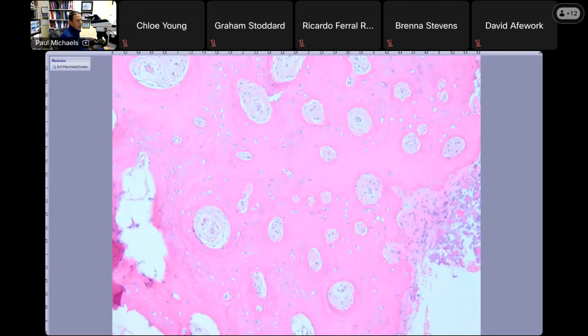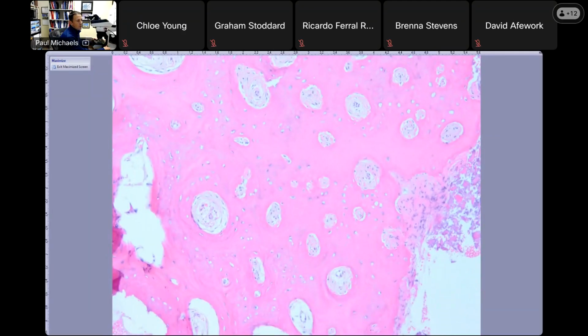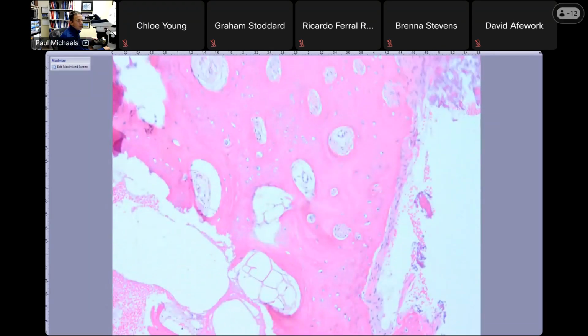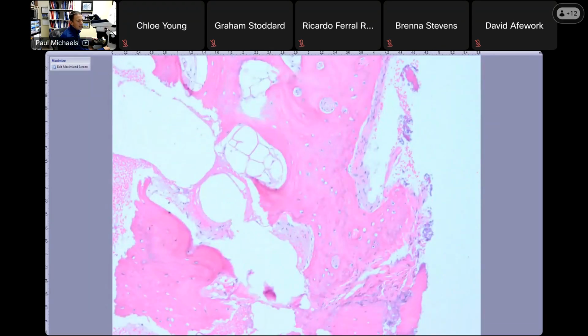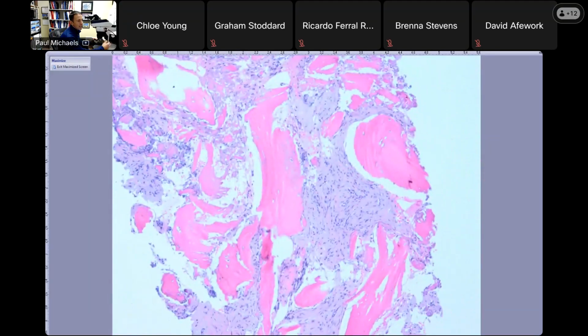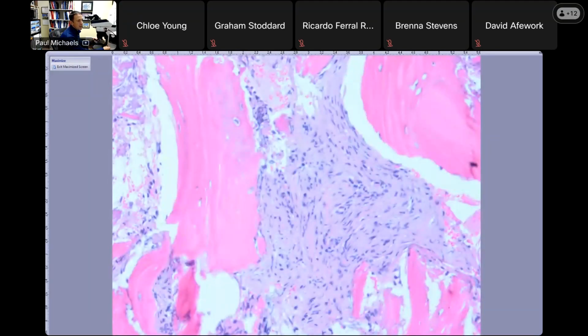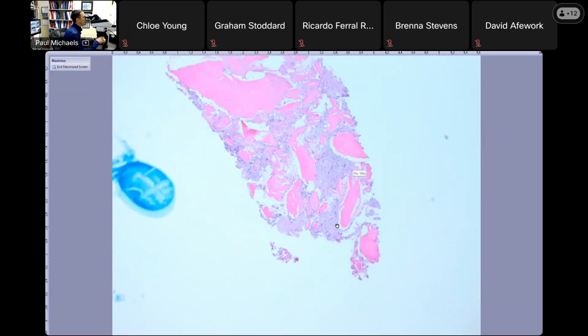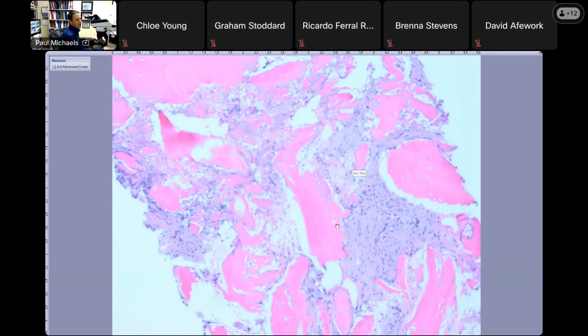This looks like reactive remodeled bone. It doesn't look like typical just lamellar, well-formed bone. It's kind of woven looking. It looks like this has kind of been injured. And then you find these areas where it looks like there's this fibrous stroma. And it looks crushed, but it kind of looks like there's something in here. Her history of breast cancer was 30 years ago. That would be weird for it to be metastatic breast, but it absolutely is possible.